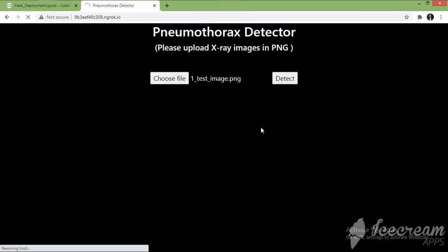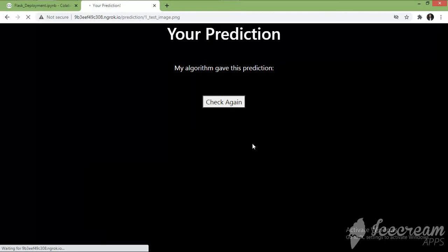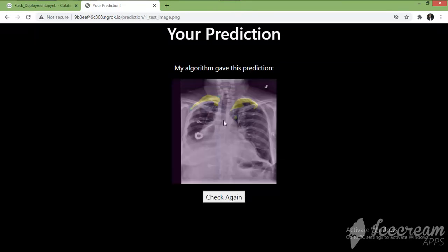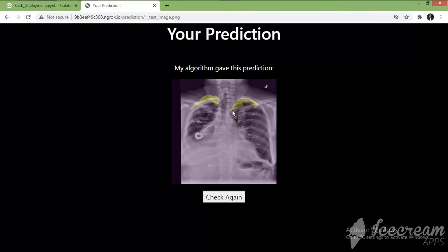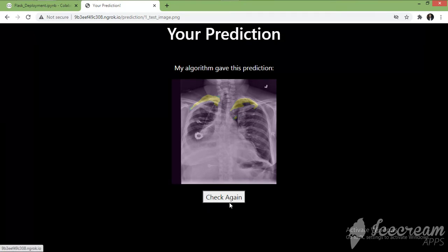Let's pass this image to the model and click on Detect. The model has predicted a yellow patch here — this was not present on the original image we passed. The model has detected that this area of the patient's X-ray has pneumothorax present, so this patient is not safe and has to go under treatment.